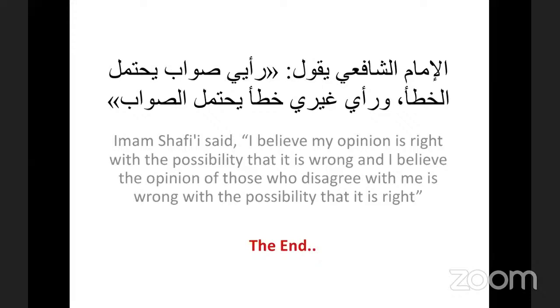Here our colleague is asking about diagnosis of MDS. For diagnosis of MDS, you need to get a bone marrow examination. You should never diagnose MDS by peripheral blood smear. And we always follow the WHO classification for that.